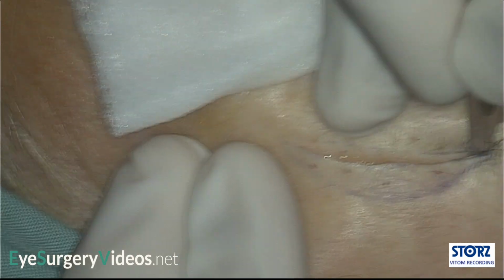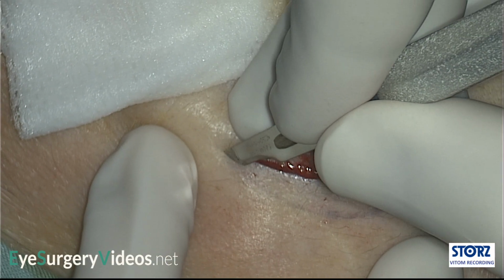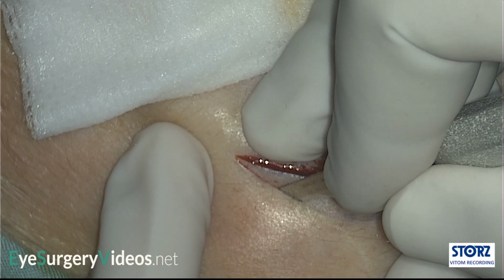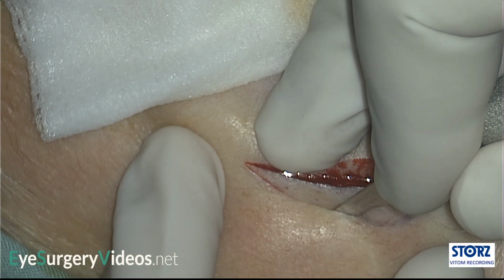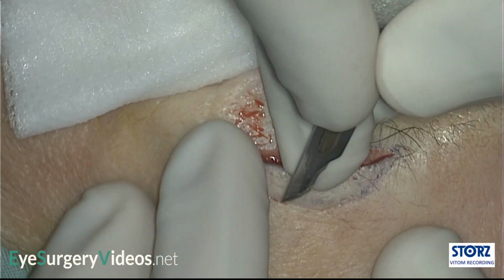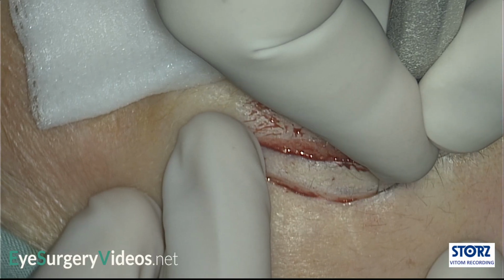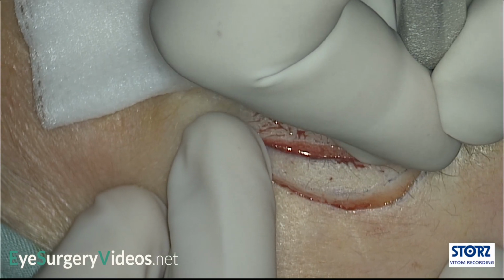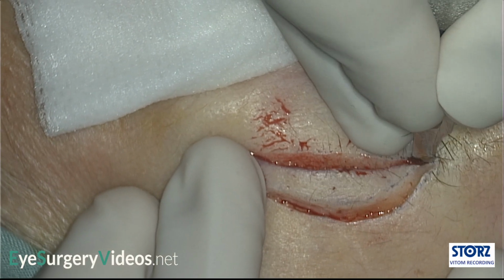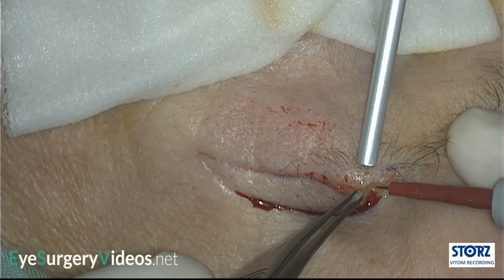The supraorbital notch can also be palpated, and the supraorbital and supratrochlear neurovascular bundles marked. The blade is being used to make a relatively deep incision, although it should be shallower medially in the region of the supraorbital neurovascular bundle. Care is taken with the angle of the blade, which should be perpendicular or even angled slightly away from the brow to minimize brow follicle loss.